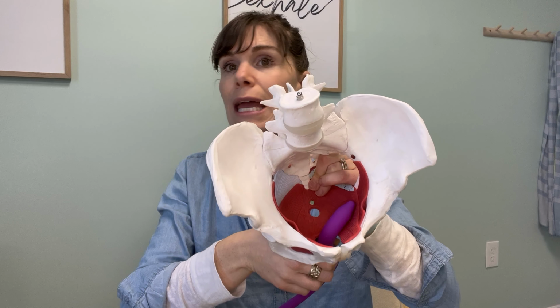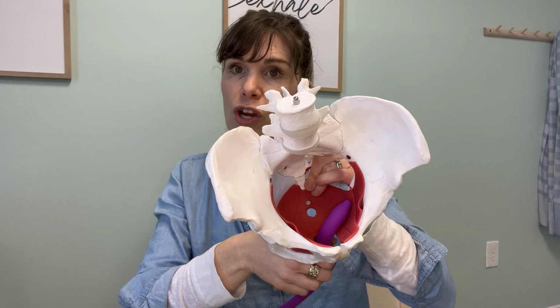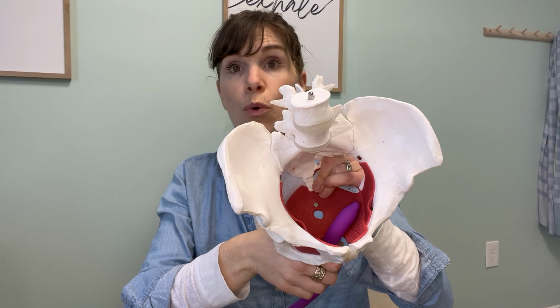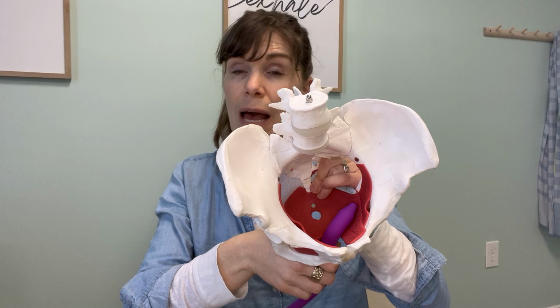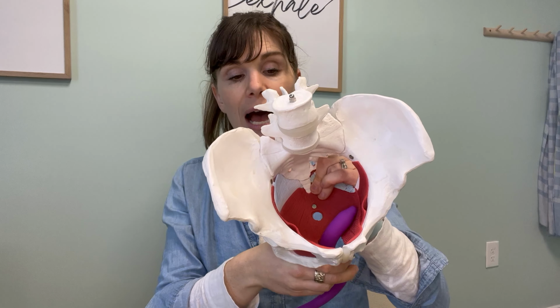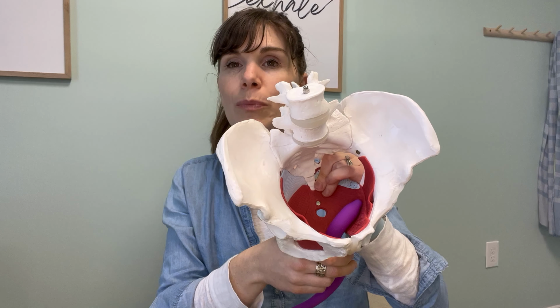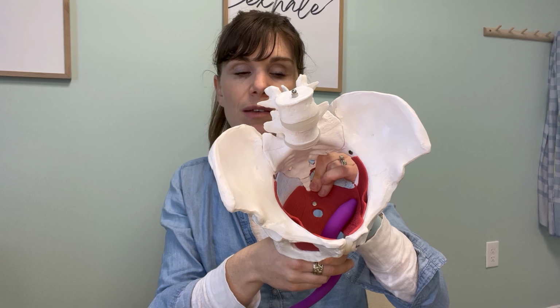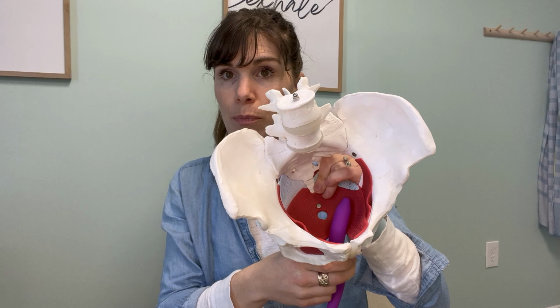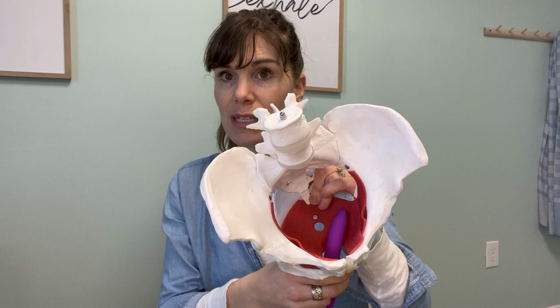Once you've done that, it may take several minutes for your body to actually respond, and that's okay. If you don't get to that point because you've semi-run out of time, again, that's okay. But ideally, you have a little bit more time to be able to devote to this. If you have time, you then move on to the next point, and you do the same exact thing.